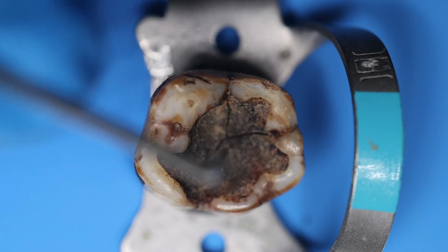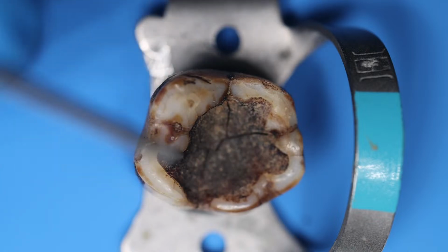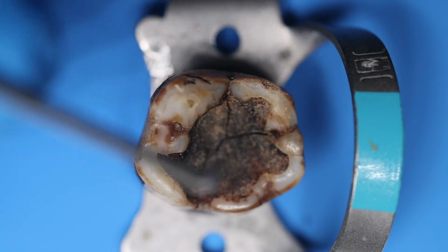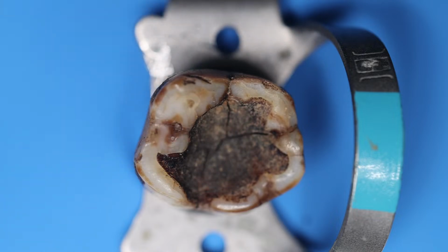However, in primary teeth there is location of canals at the periphery, but if we are talking about this permanent tooth, mostly when we approach from the center and remove the caries, we are just into the pulp chamber, and we can easily locate the canals in the mesial aspect.